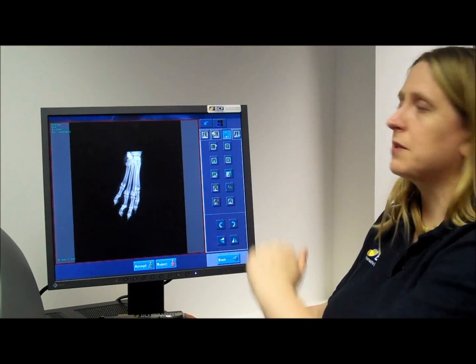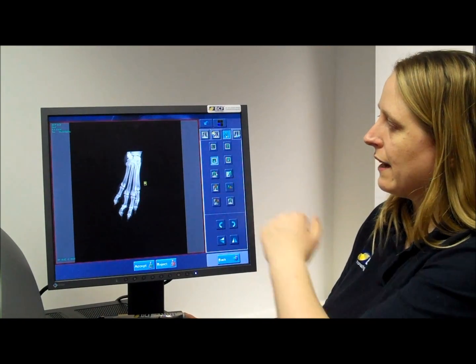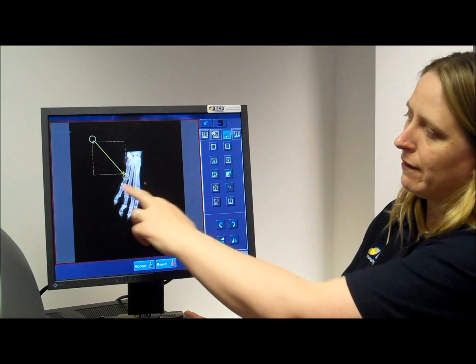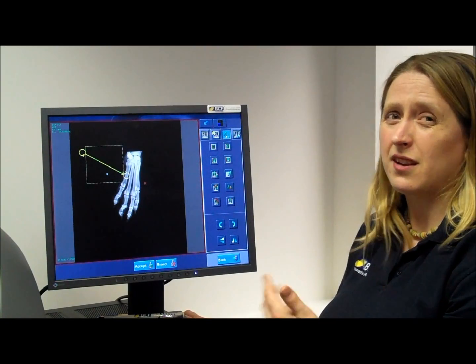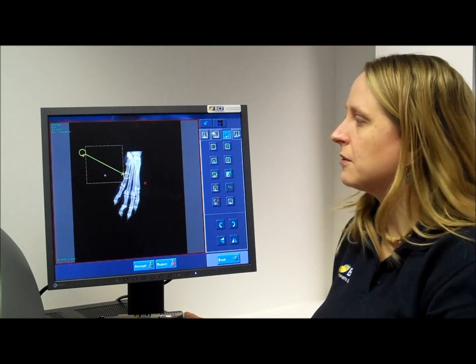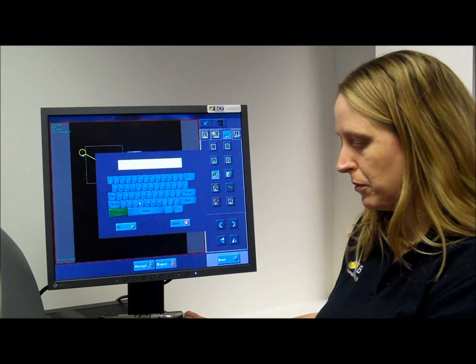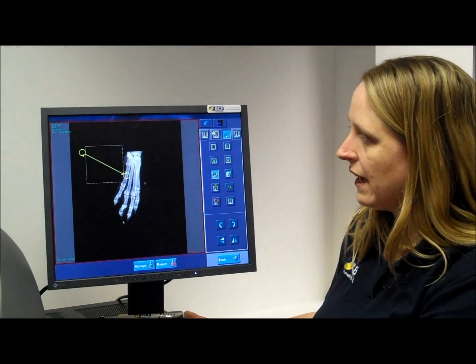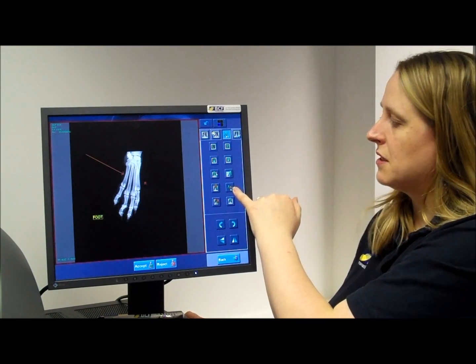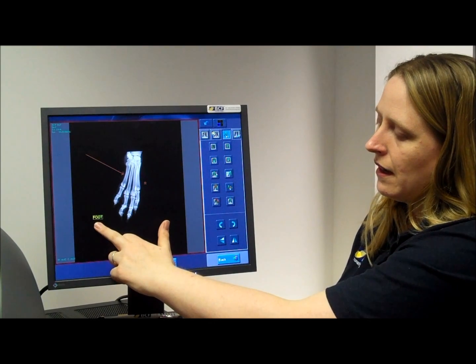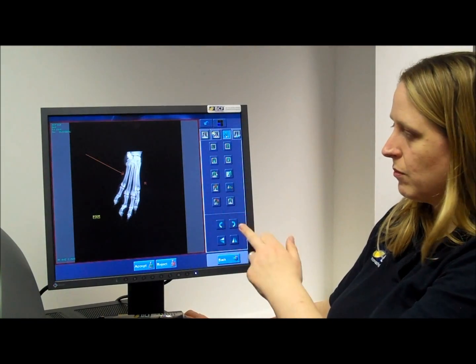If you need to add a left or right marker because you managed to miss yours off — easy to do — click onto the marker you need and drop it where you want it on the screen. You can also add arrows, and one of the new functions is that you can stretch your arrow and move it, and you can add multiple arrows as well. This can be quite nice if you're going to show the pictures to the owner, so you can have an arrow there to help explain to them where the pathology is. Additionally, you can free type text and drop that onto the picture using your keyboard or the virtual keyboard. Once you've typed some text in and hit OK, just tap on the screen where you want it, and that's where the text will appear. You also have the option to change the size of the text — as you press the button, you can see the text gets smaller and larger. I tend to keep the text quite small, because you don't want it over the top of anything important in the image. Here is also where the rotation and flip buttons are.